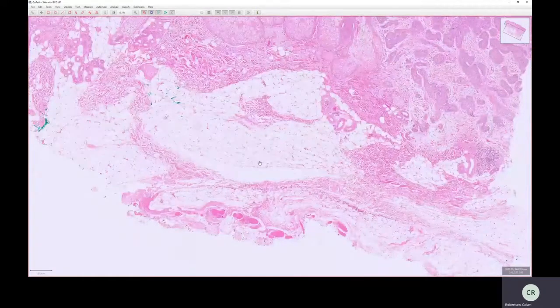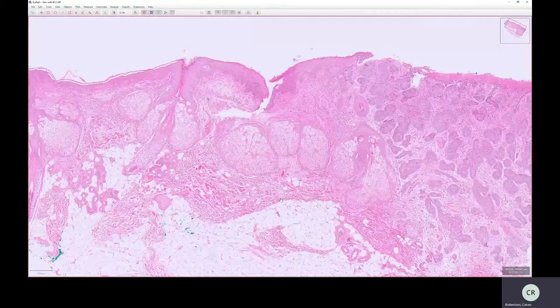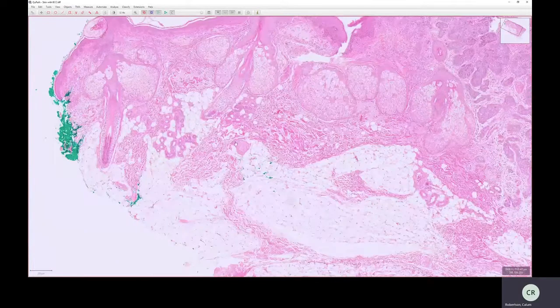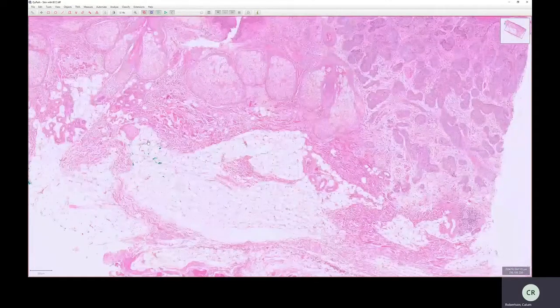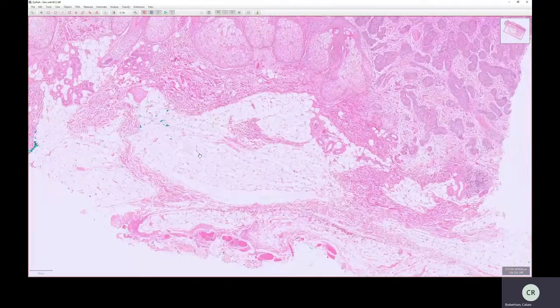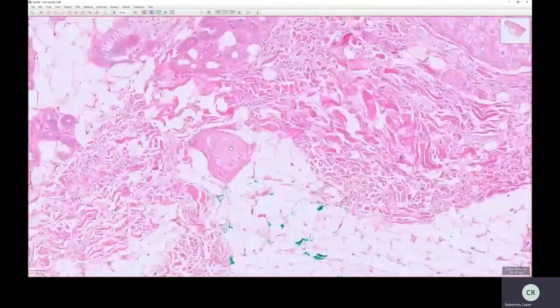We'll cover smooth muscle when we see a GI biopsy, and we'll see a better example of that. The next main tissue type that I'm going to cover is neural tissue. Our biggest interaction in general pathology with neural tissue is through nerves in tissue sections. And here is a really good example of a nerve.